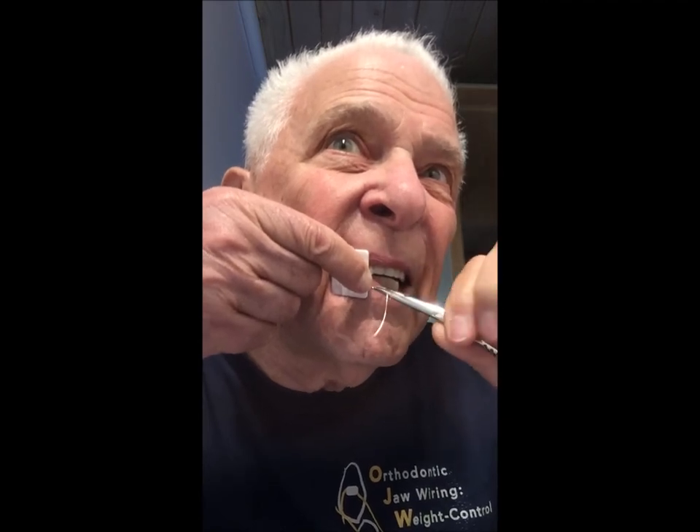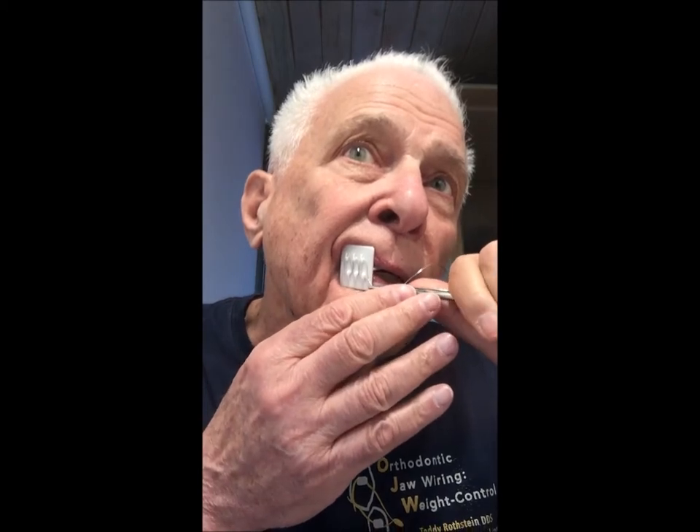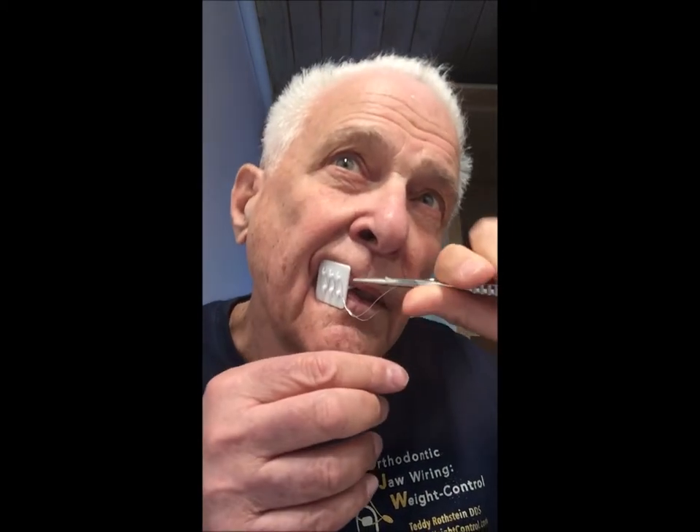And meeting the bottom half of the wire. Taking the twisting instrument, grabbing both wires, holding them to make some twisting. Taking a look to see if there's too much wire or too little wire. Adjusting it as necessary. Making more twists if needed. Cutting away the excess. And folding the wire out of harm's way.